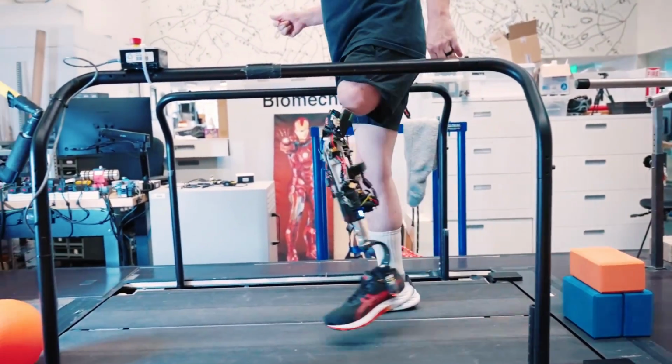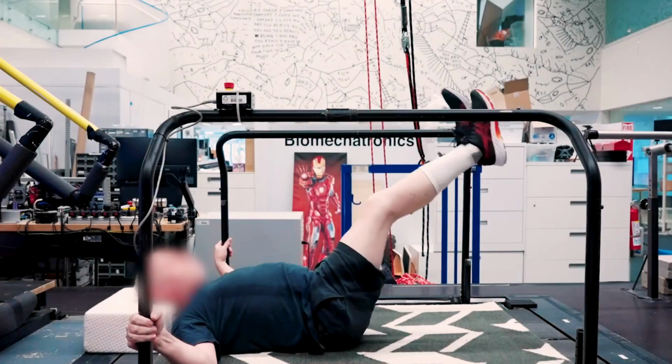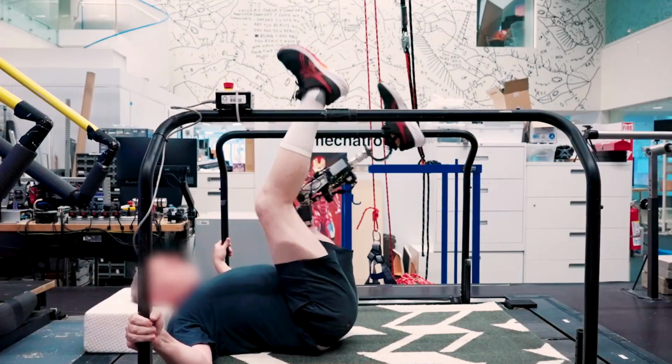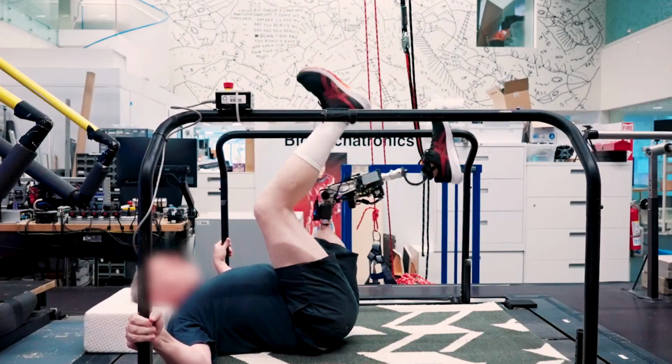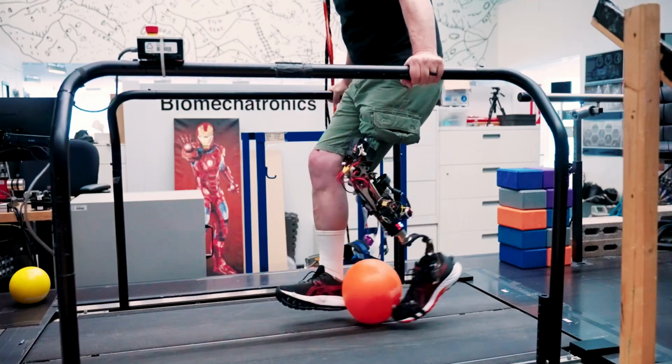The new bone-integrated system, dubbed Enhanced Osseointegrated Prostheses for the Rehabilitation of Amputees, or EOPRA, is said to not only help patients walk faster, climb stairs, and avoid obstacles with ease, but also provide greater stability and control over movements.